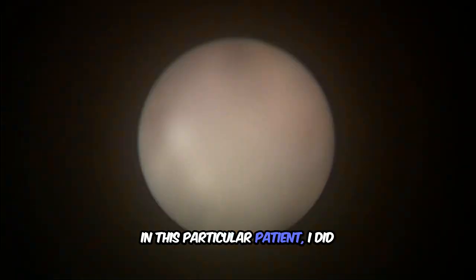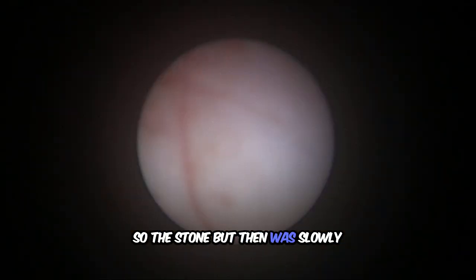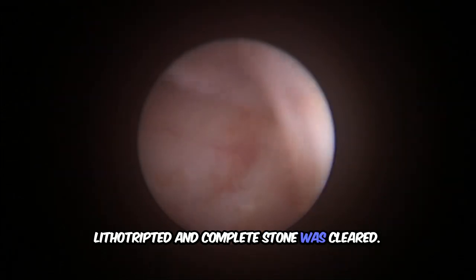In this particular patient, I did not dilate to 20 French. It was a mini perc. Dilatation was done only up to 16 French. So the stone burden was slowly lithotripsed and the complete stone was cleared.